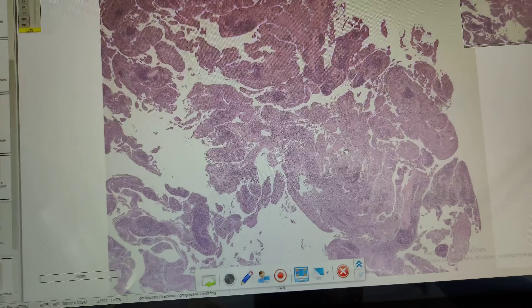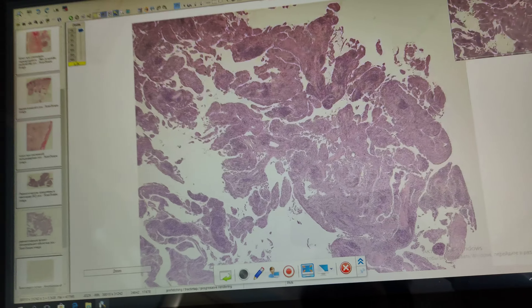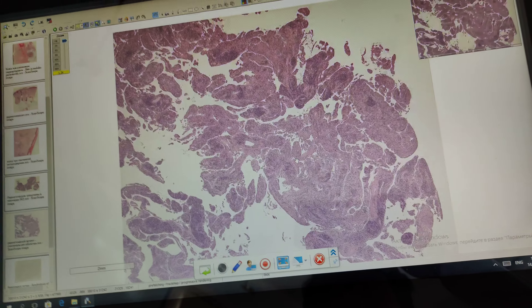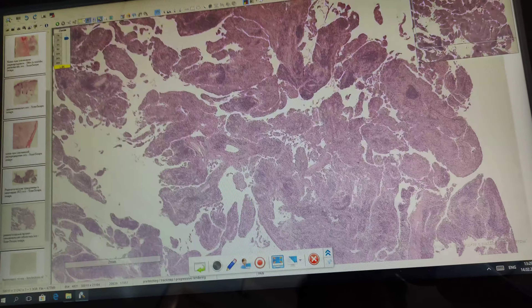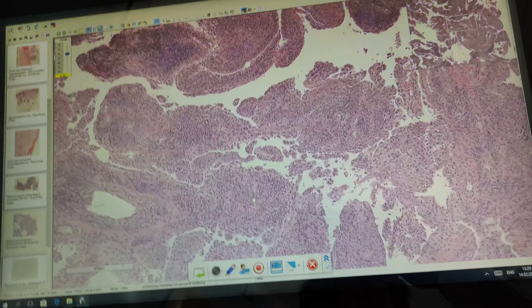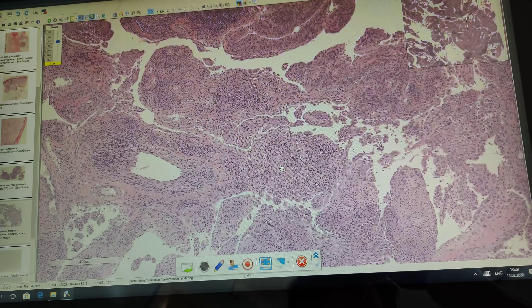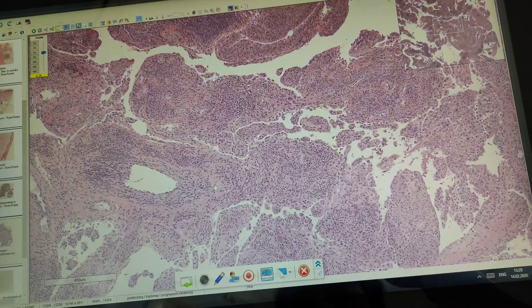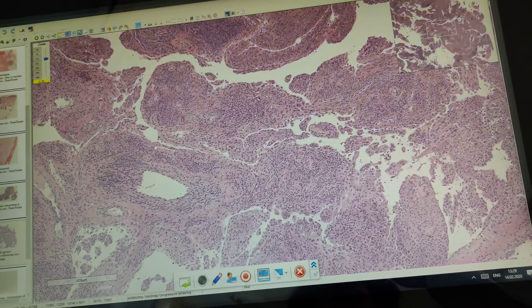Synovial membrane in rheumatoid arthritis. You can see that this is a fragment of synovial membrane stained with hematoxylin and eosin.